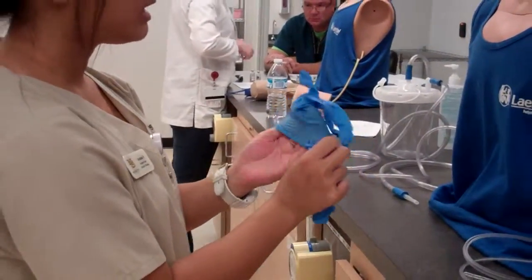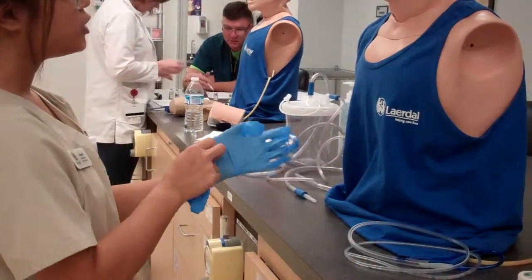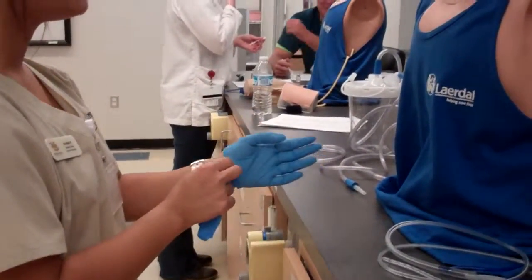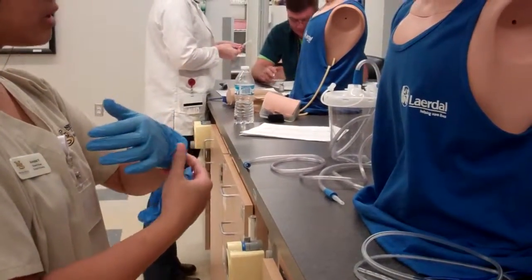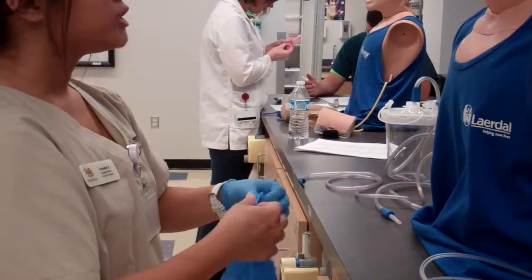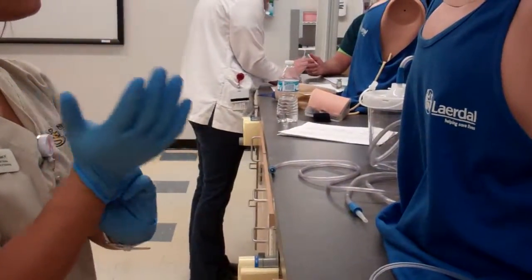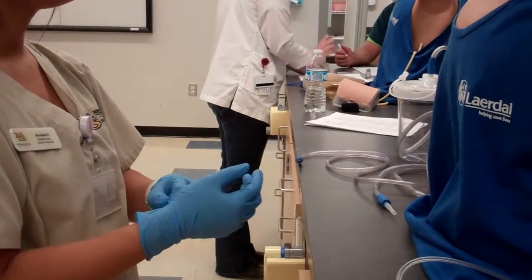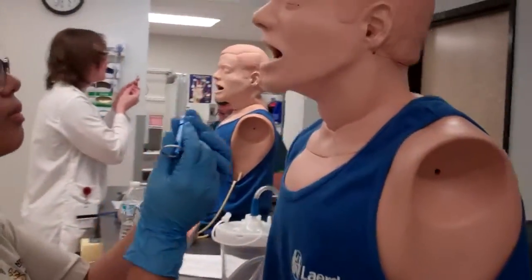So Dr. Kaufman has ordered the NG tube procedure for you today. Do you know what an NG tube is? No? Okay. So it's a tube that goes into your nose, all the way down into your stomach, and it helps remove gastric secretions. And may I ask if you have any allergies? No allergies? Okay. Have you had any past medical history of nasal polyps, inflammation, severe nosebleeds, or any of that? No? Okay. So I'm going to go ahead and check your nose.